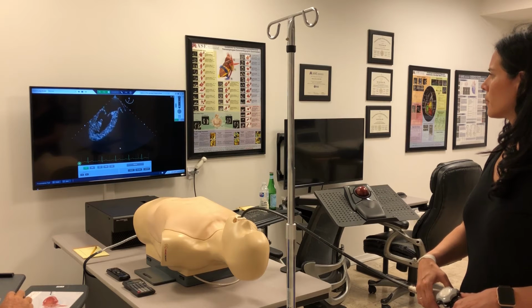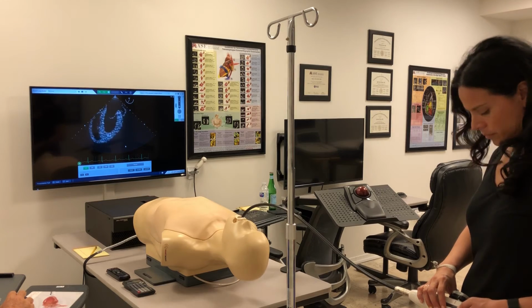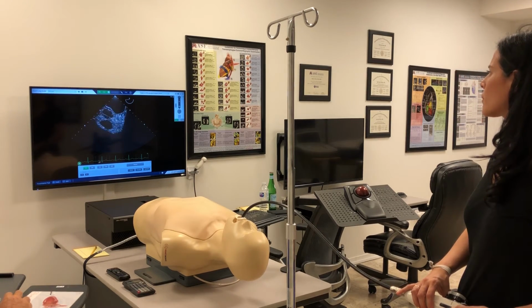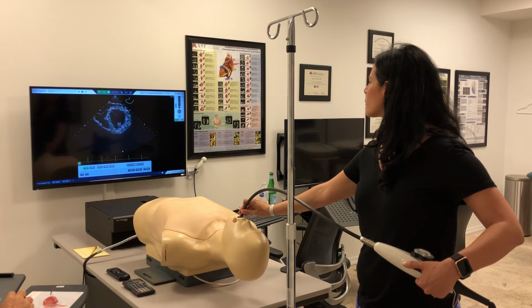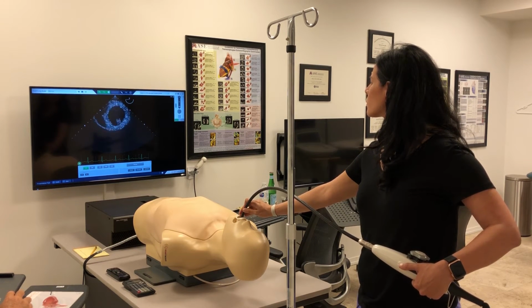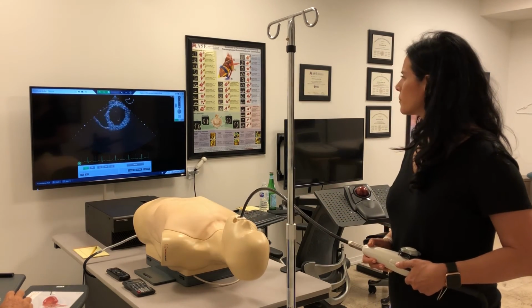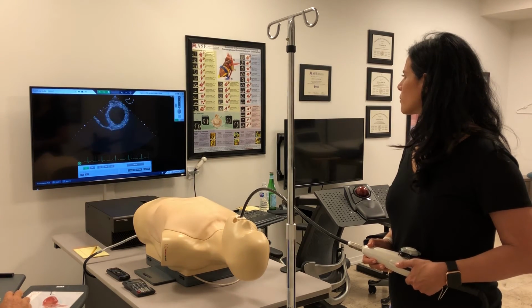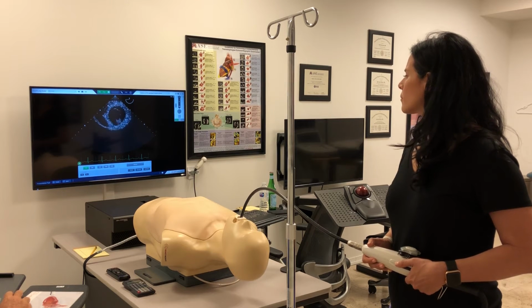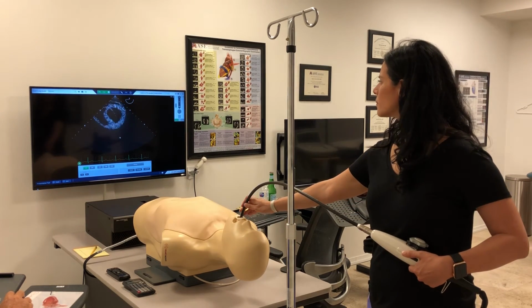Now we're going to go down into the stomach. So to go to the stomach, I'd return to 0 degrees of omniplane and follow the left ventricle down, trying never to lose the left ventricle. There's the coronary sinus. Let's stop there for a second. This illustrates the junction between the distal esophagus and the stomach. So when you see this coronary sinus here emptying into the right atrium, that's an indicator that you're at the gastroesophageal junction. Now, let's go ahead and push gently further to enter the stomach.